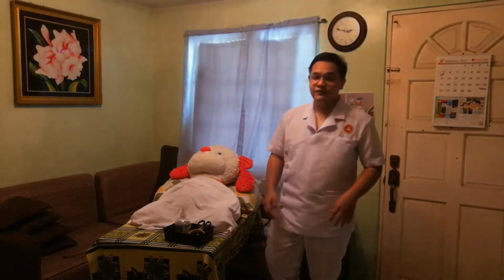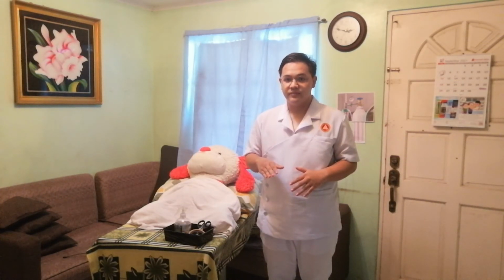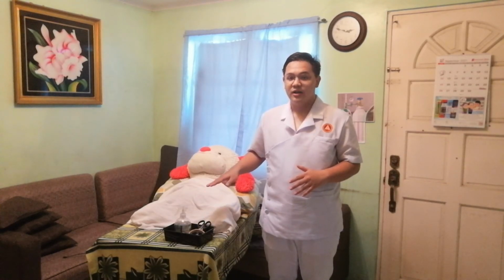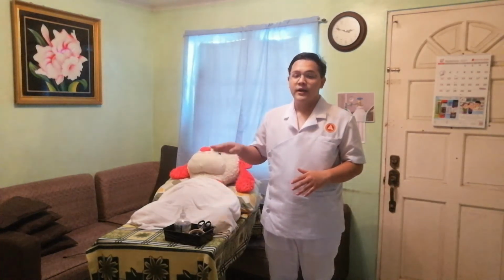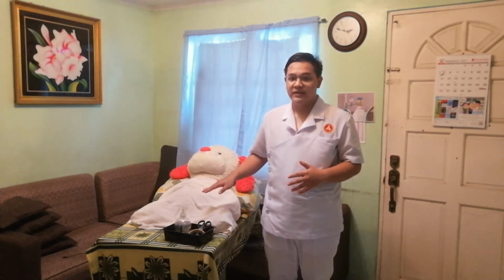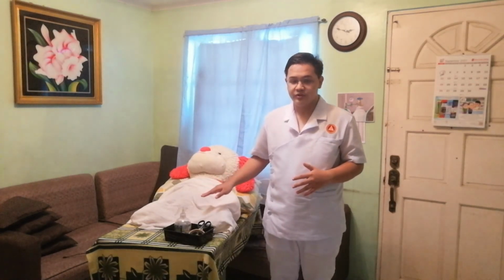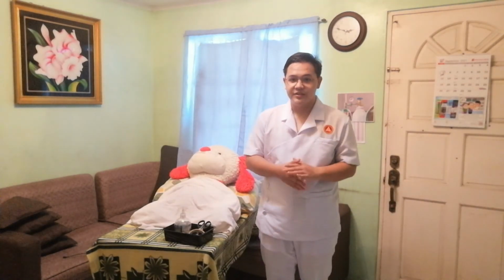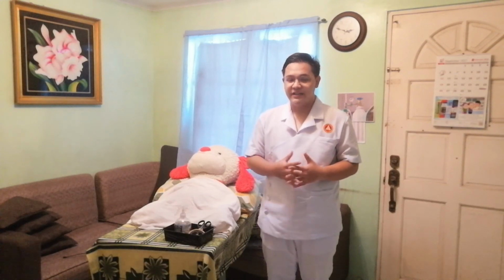And now for our evaluation phase. So first thing that we need to do is compare our baseline data or findings that may deviate from what is expected or normal for our client, and we will need to relate these findings to the previous data if available, and also we need to report any significant abnormalities or findings that may deviate from normal to the primary healthcare provider. And that would be all for the performance of the administration of oxygen to our patient via nasal cannula.